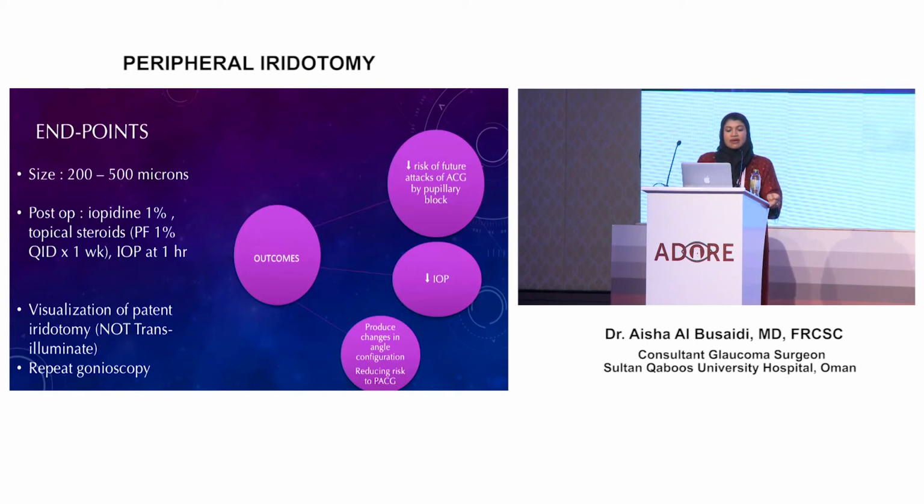The endpoint is really having 200 to 500 microns of diameter of the opening. Post-operatively, you instill a drop of Iopidine, give topical steroids for a week, and check the IOP an hour after the procedure.